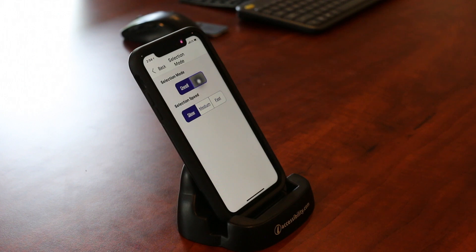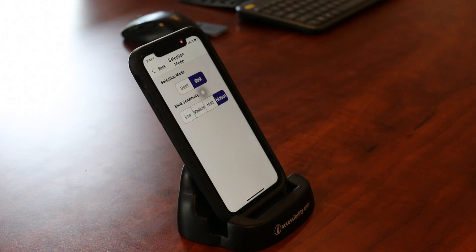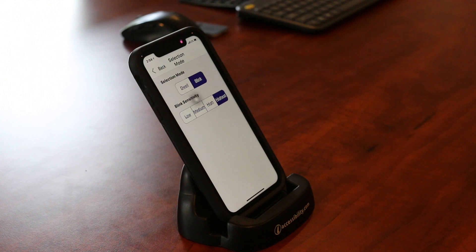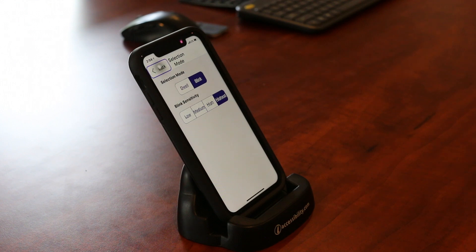I'm going to turn this back to blink because I like to use it a little bit more. And then blink sensitivity — I can turn it up from low, medium, high. I keep mine at the highest. I like it to know as soon as I blink that I want to select something.